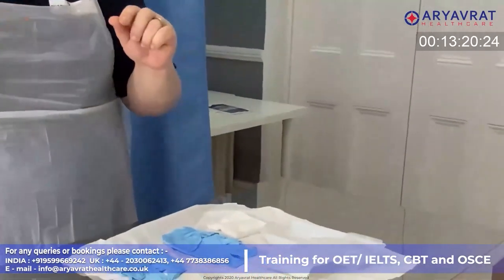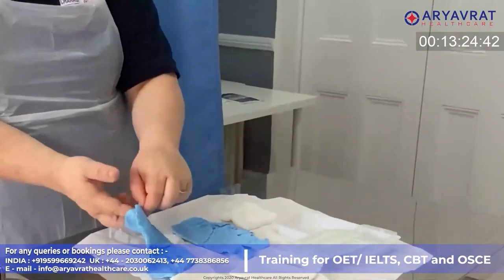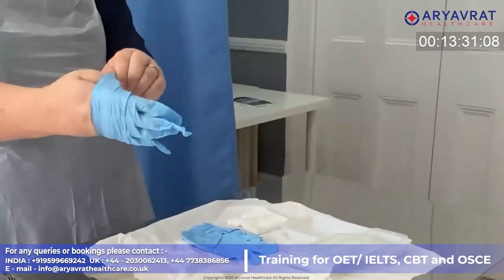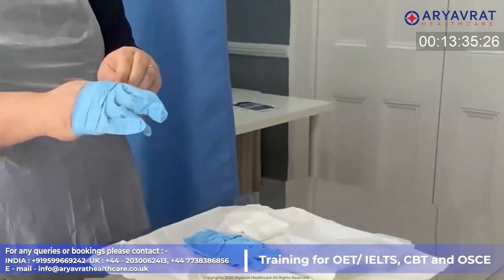I am going to put on my sterile gloves, making sure that the first one I touch the inside of the glove only. If I can find my thumb hole.